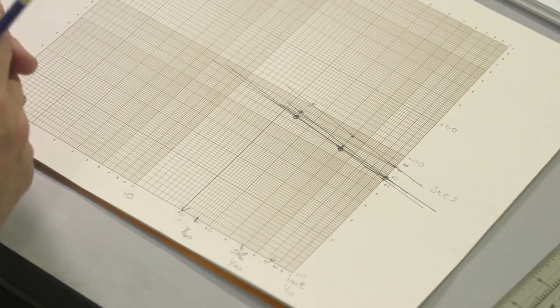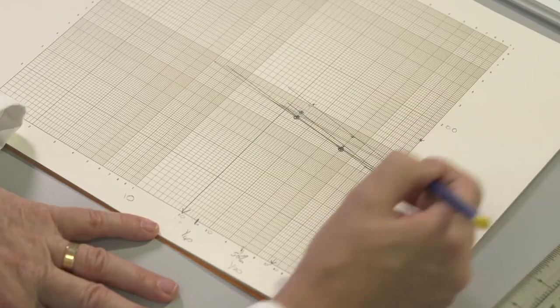Turning now to the third patient sample. The 1 in 10 dilution, 141 seconds. The 1 in 20 dilution, also 141 seconds.